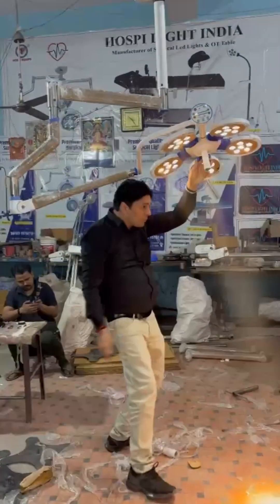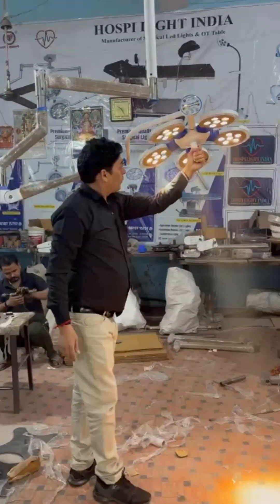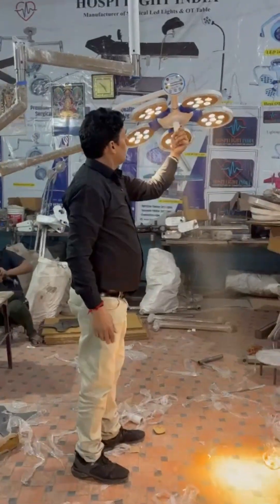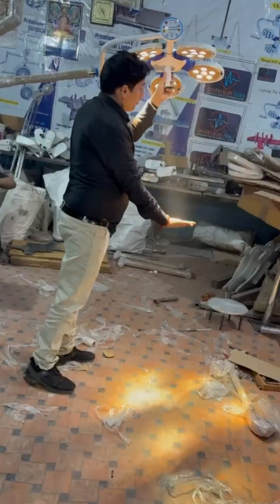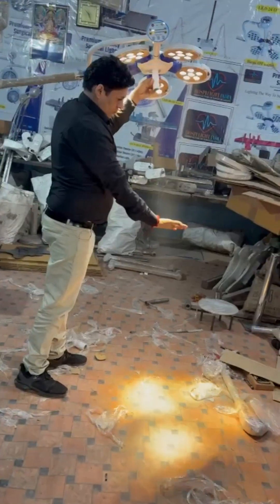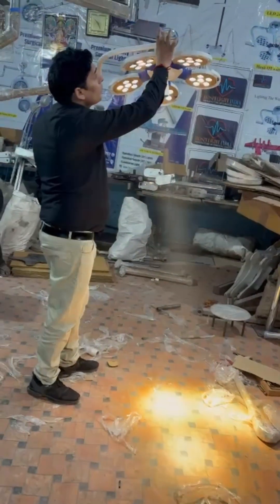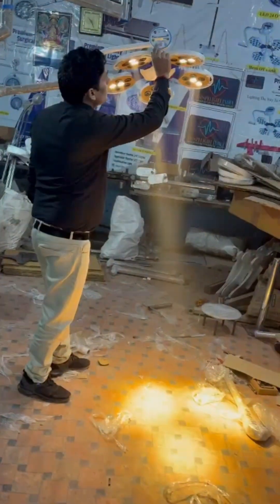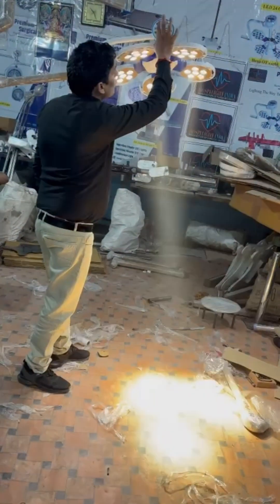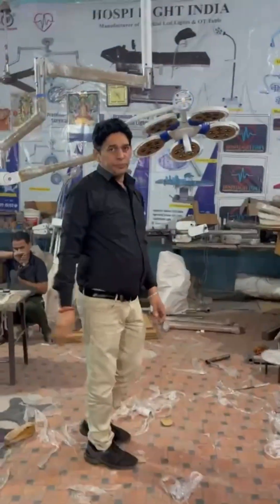Fully rotate and dome position has been working as per your requirement. Adjustable focus on this light. The light comes with a shadow-free digital controller, with intensity controlled digitally and single LED technology.